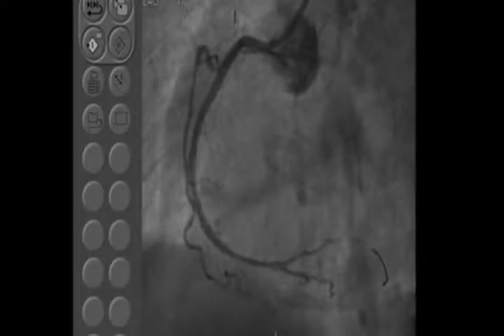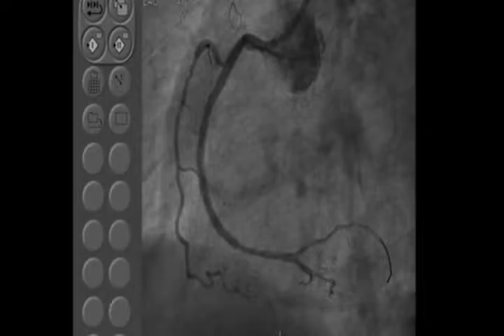Okay, 3.5. I'm sure they are taken in the angiogram after the... We did only 14 atmospheres. Okay, going to do high pressure now. Can you play back? I'm going to 20. 18, 20. Before, yeah, angiogram. Can you see? This was after the IVUS.